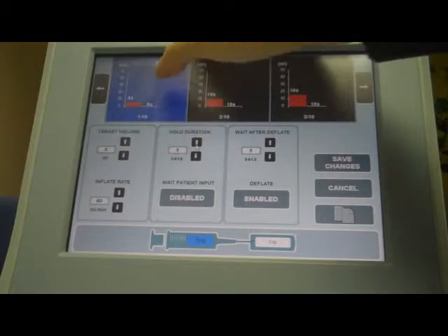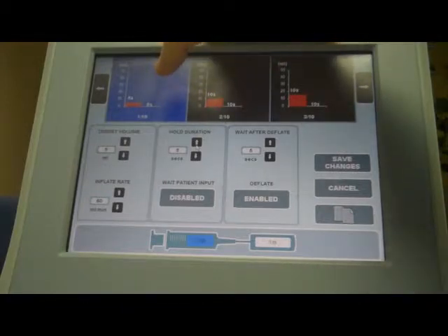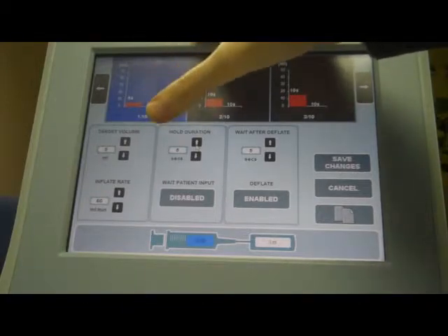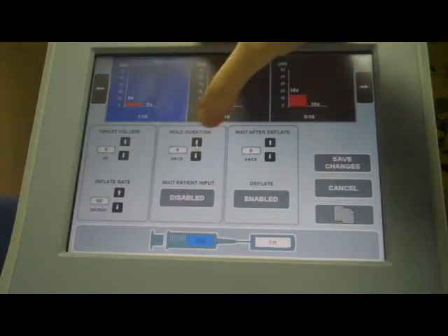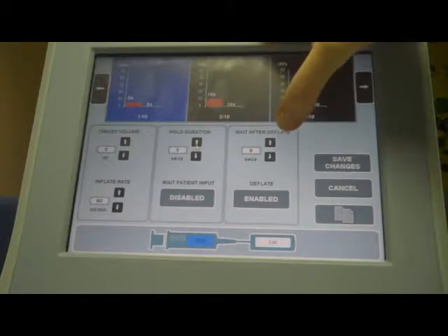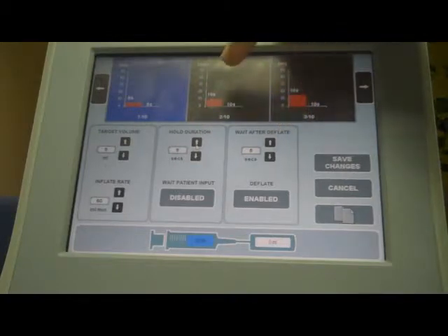So what will happen for this step now: we'll inflate to 5 at a rate of 60 mL/min, we'll wait there for 5 seconds, then we'll deflate, and then we'll wait for 5 seconds after that.